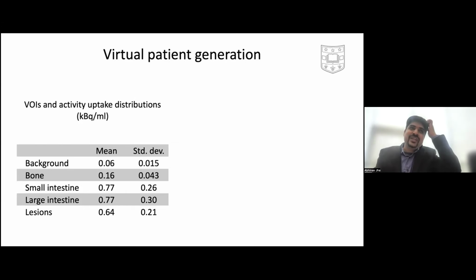Oh, that's a great question, actually. In this case, we did not have the data to be able to quantify the covariance. And I think probably for these values the correlation would have less effect, but for our pharmacodynamic parameters, that's one thing we're trying to address with limited data, how to deal with correlation and so on. And this is always going to be a challenge with VITs, because if you knew everything, why would you do a VIT?